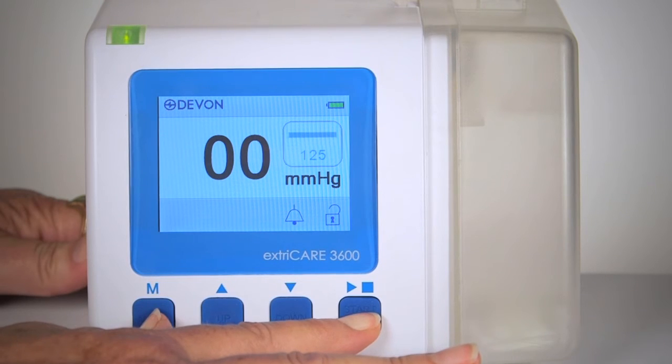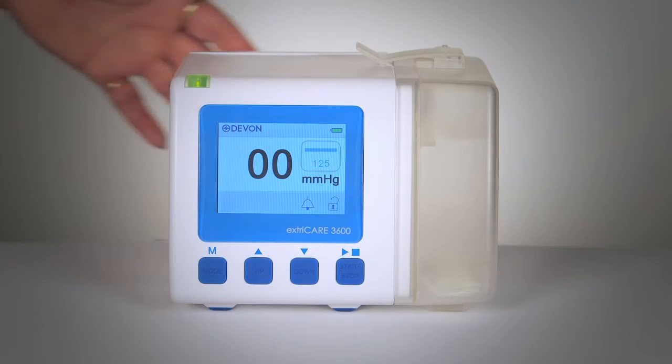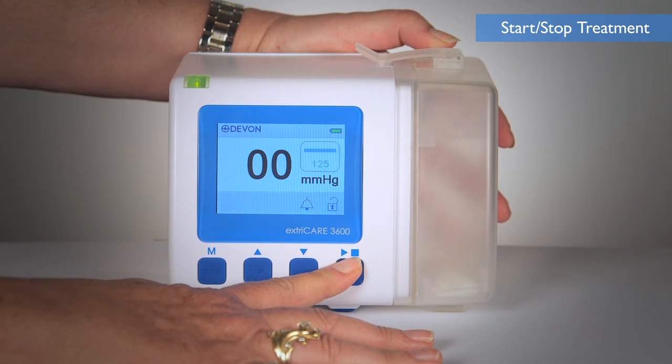If an alarm sounds when the device is locked, the backlight to the screen will turn on and the alarm will display. To start or stop treatment, press the Start-Stop button for 2 seconds.